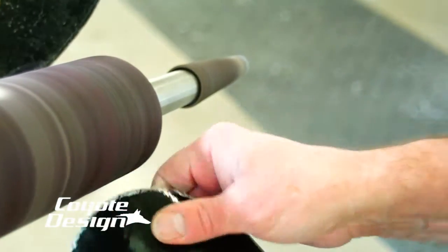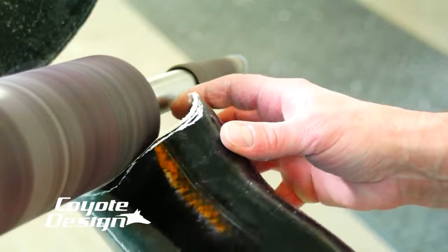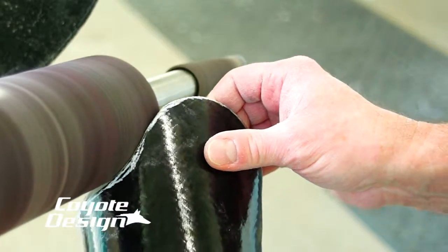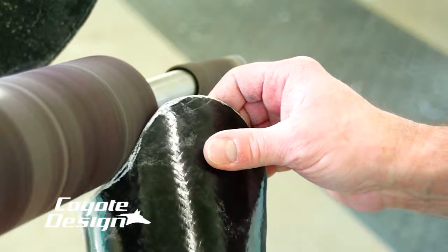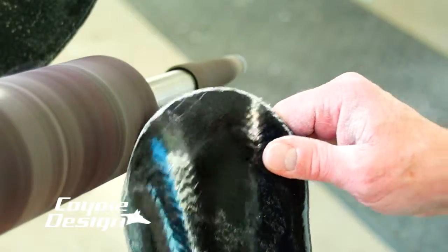I sand my Coyote composite almost the same as I do plastic or any other carbon socket. I turn the wheel on high, run across my inside edge, my outside edge, and then get ready to polish it.